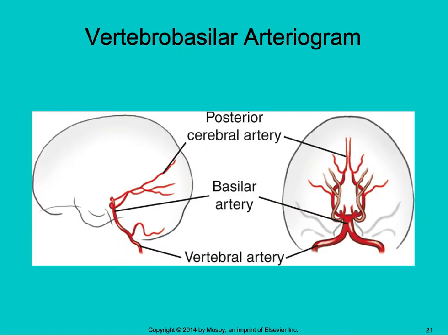So our vertebrobasilar arteriogram is when you're visualizing the vertebral arteries, the basilar arteries, and the posterior cerebral arteries. So that's the vertebrobasilar arteriogram.